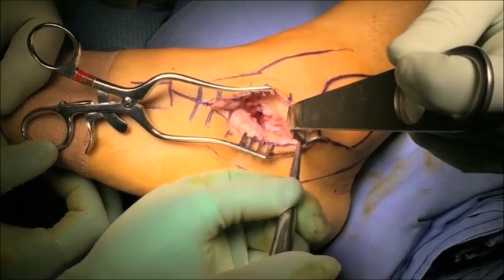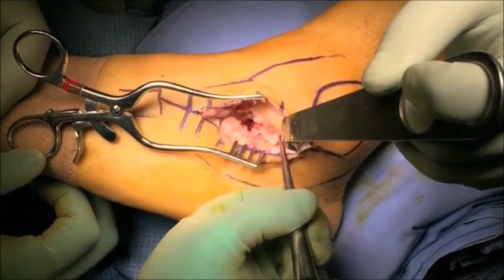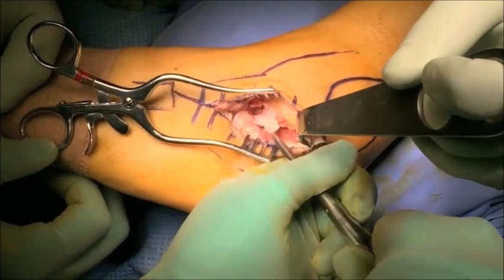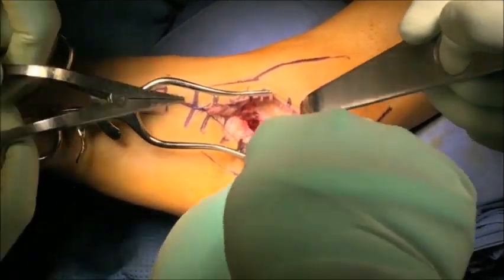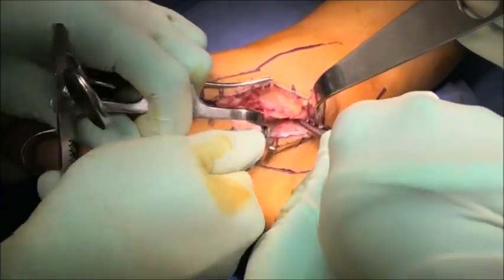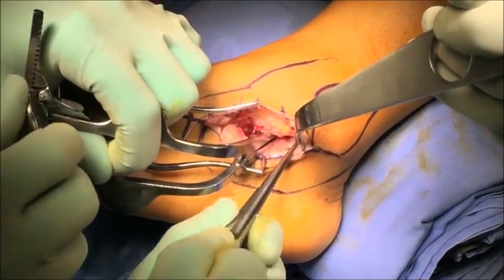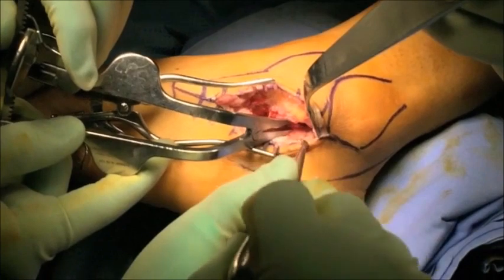A spine curette is a great instrument for removing debris in these tight joints. By removing the lateral half of the cartilage, we have now made space to insert a smooth lamina spreader. The lamina spreader is first placed in the anterior half of the joint and opened up, so we can start better visualizing the full extent of the posterior facet.